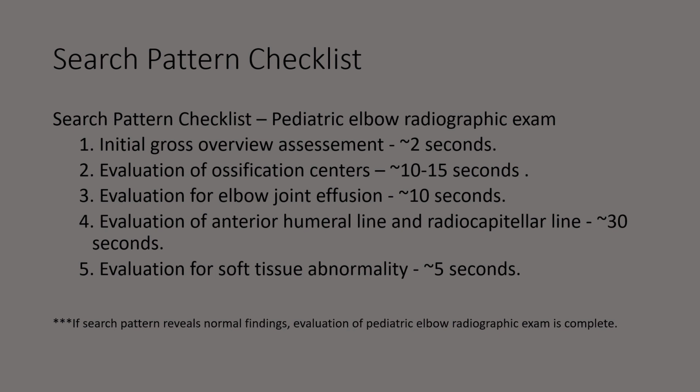If the search pattern reveals normal findings, evaluation of the pediatric elbow radiographic exam is complete.